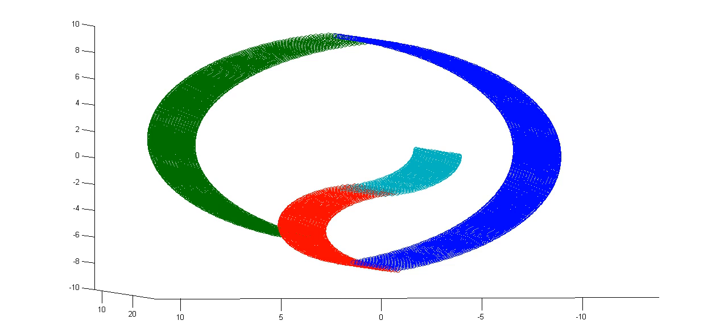Whereas the big deal with fMRI is that you're taking a bunch of images of the brain at a relatively fast timescale, like once every second or once every 2 seconds. And so you're only averaging the data over a short period of time, like the 1 second between frames, between pictures of the brain. And you can see very small changes, on the order of 1 to 2%, in the grayscale images that correspond to this.